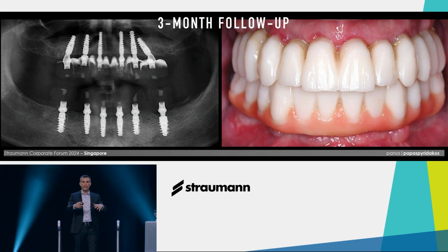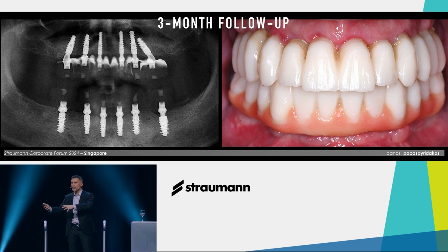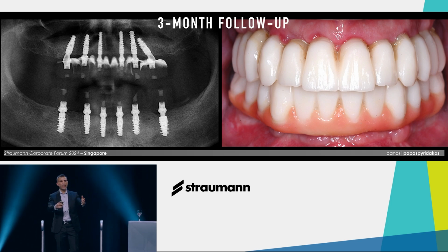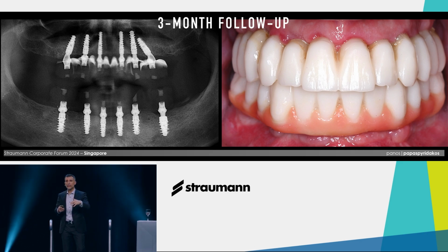Let's go back to Gary. How did we implement this new concept for the treatment of this double arch patient? So 3 months later, the implants are integrated. If it is an analog workflow, we take impressions of the provisionals and we take impressions of the implants. But now we will do it digitally.